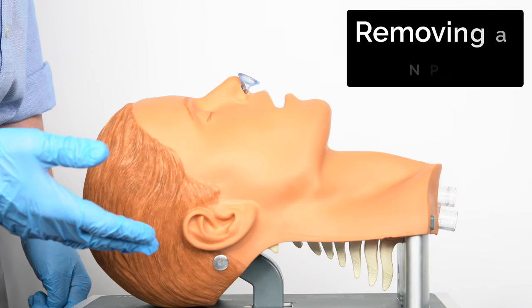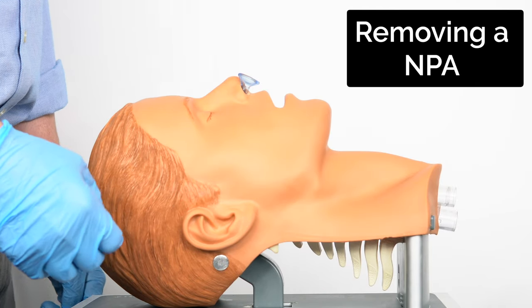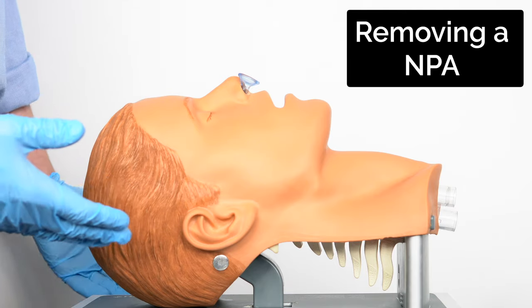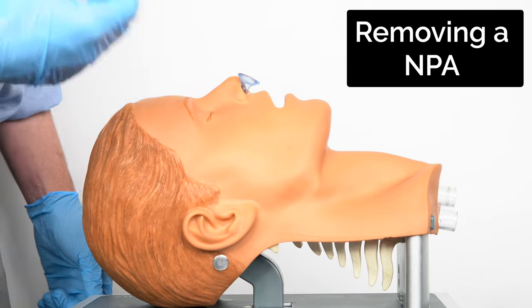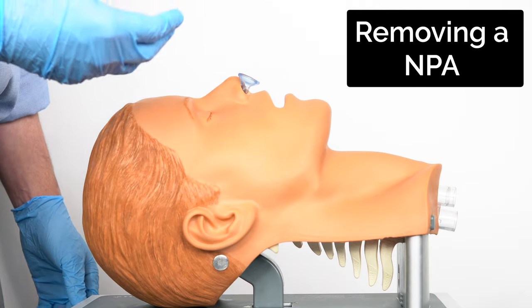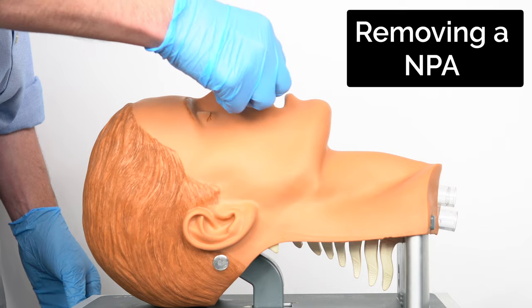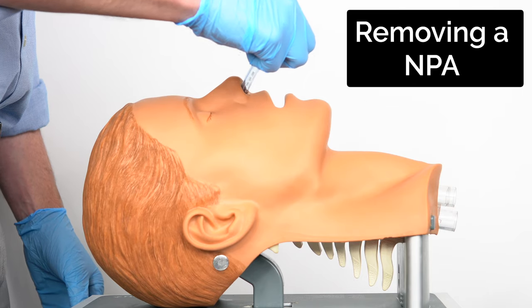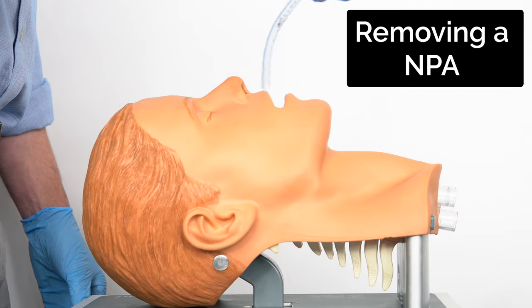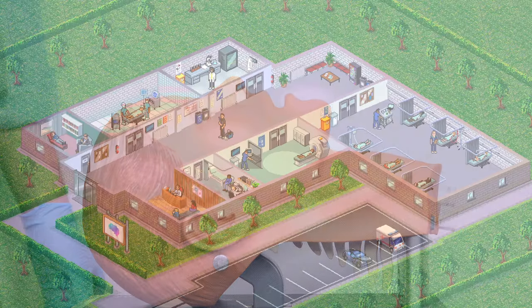When it comes to removing these — because they're so well tolerated — the patient may well be sat up, talking, and be able to take it out themselves. If they are unable to, or they want you to do it, it's literally a question of just pulling on the flange and it will come out very easily.